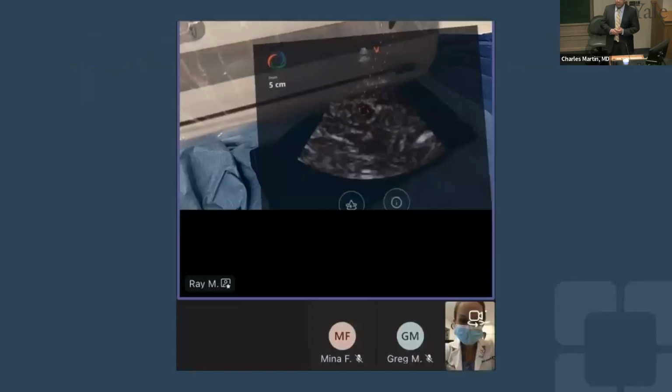And you can focus on the procedure a little bit more. This gets into one of my more important projects, teleprocedure and telecollaboration. In the process of being able to transmit that ultrasound image holographically in the system, we started working with Microsoft, and we realized Microsoft has a Teams product that also works for the HoloLens. It's called Remote Assist. Working with them, we developed a module where we can broadcast exactly what we see under that ultrasound image over a distance.